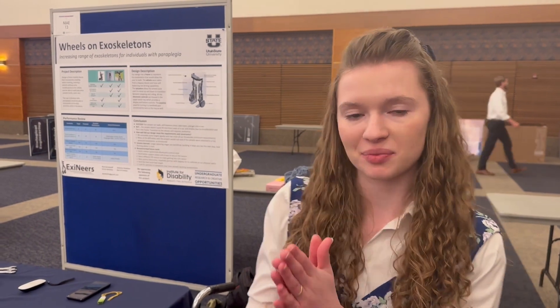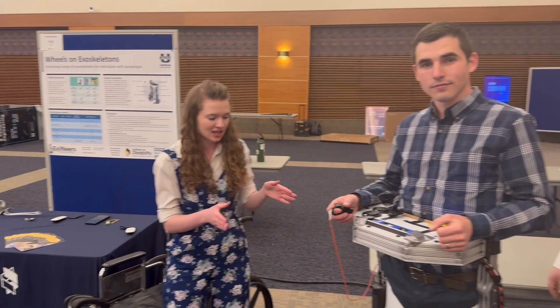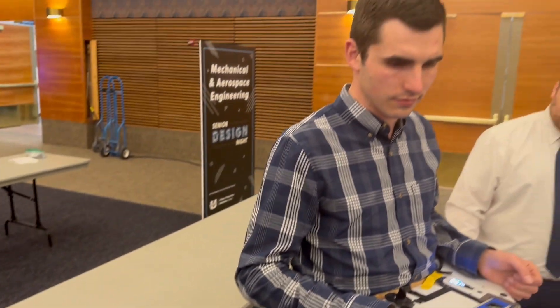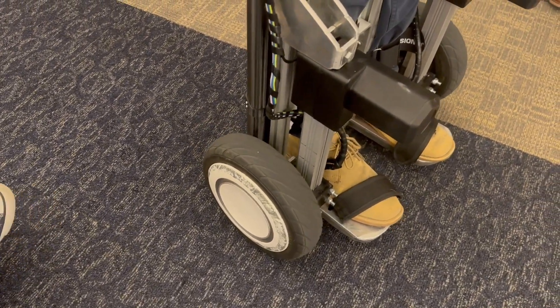This project is a mobility device that takes the best parts of a powered wheelchair and an exoskeleton and merges them into one device using a Segway as the base. Our device has the Segway wheels and this frame that represents an exoskeleton, and he can move the wheels up and down so that he can transition between a rolling travel position and also being able to take steps.